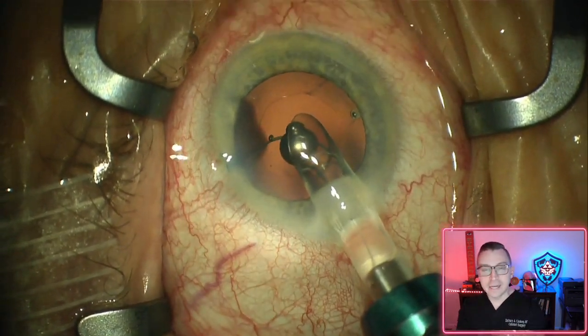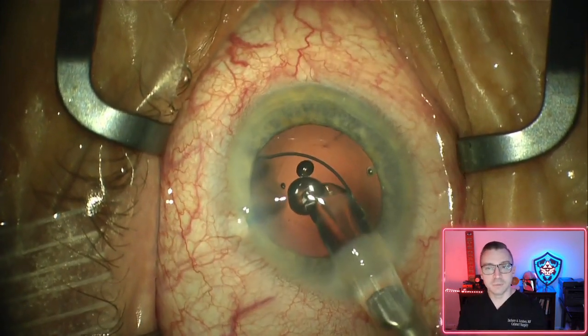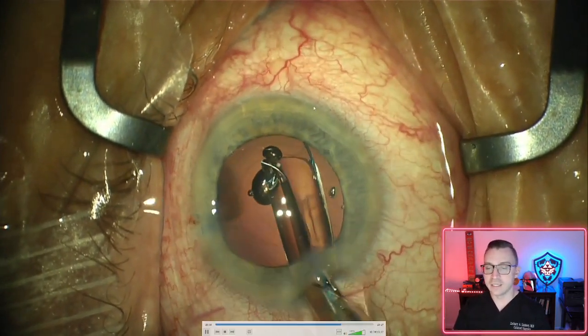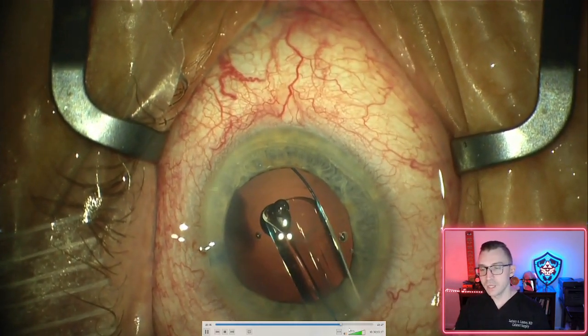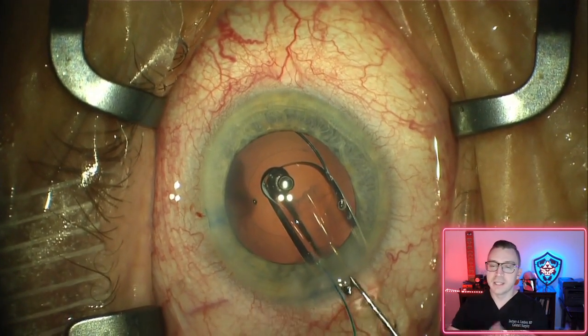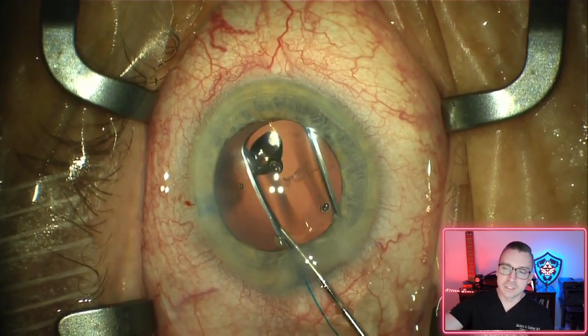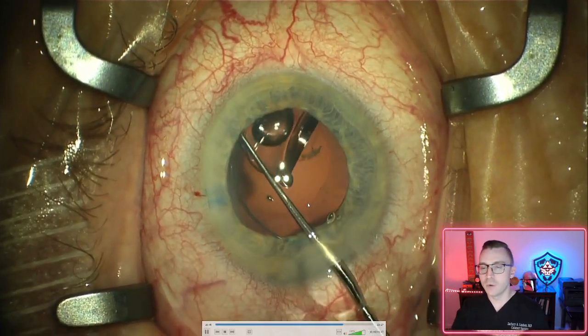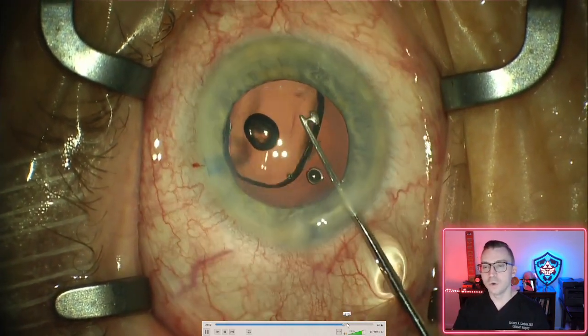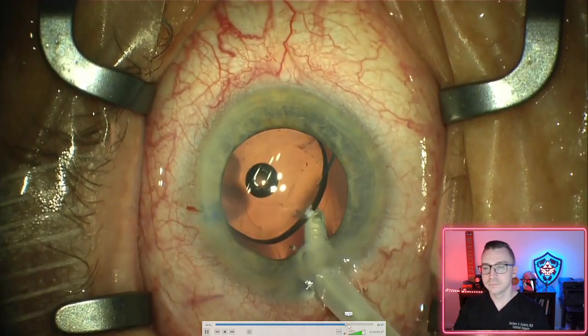We're going to insert it into the capsular bag. That's the bag that we now have, that the cataract has been removed. We have this nice empty bag to put our new lens implant into, and it's going to sit very nicely inside of there. The lens goes in, it's kind of folded up like a little taco shell. It goes in there, it begins to unfold. I'll then use that instrument to dial the lens into place exactly where I want it, get those arms, those haptics into place to hold the lens very securely.